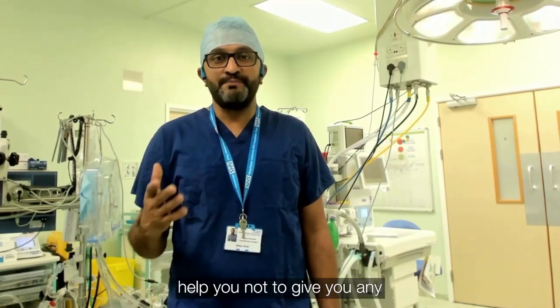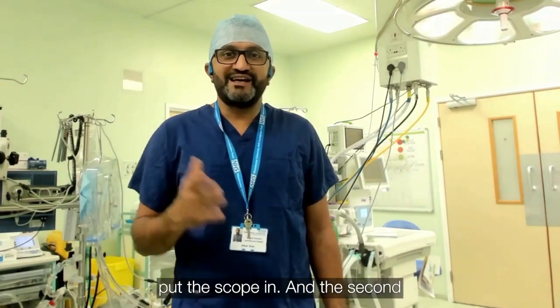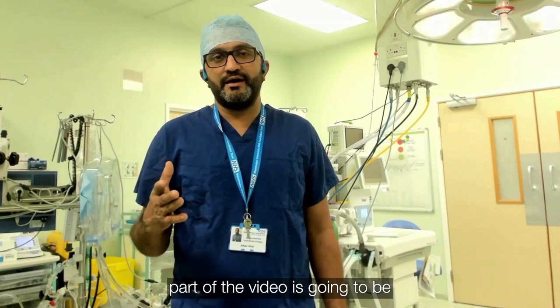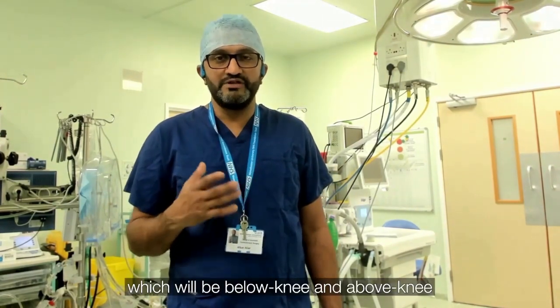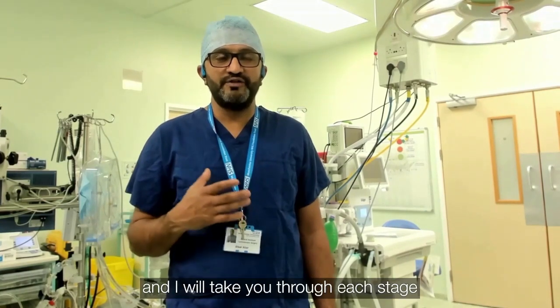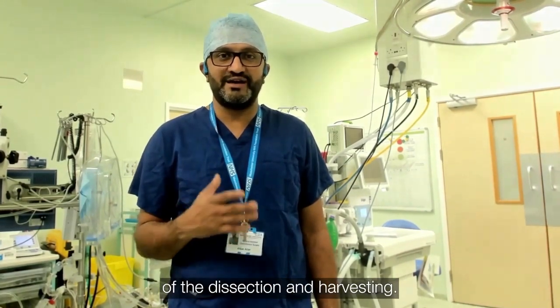It will help you avoid any surprises when you actually put the scope in. The second part of the video is going to be the live recording of the vein, which will be below knee and above knee. I will take you through each stage of the dissection and harvesting.